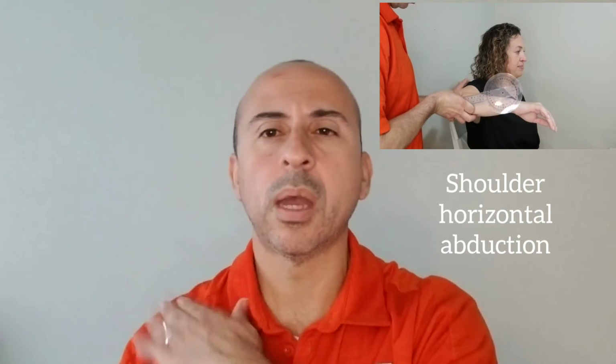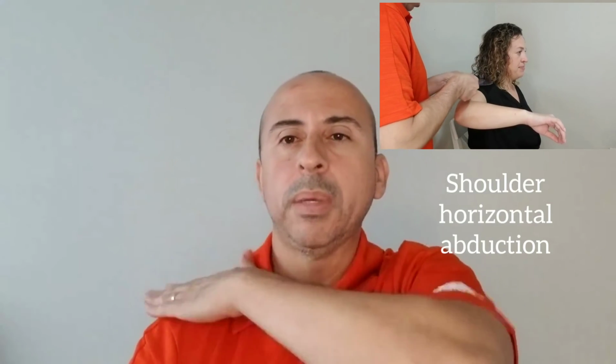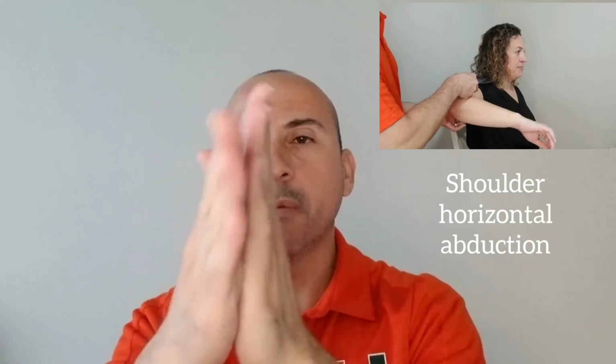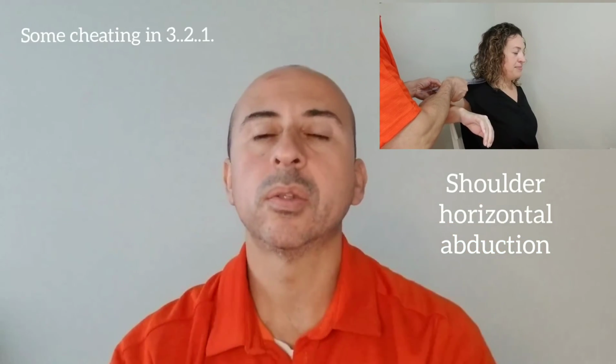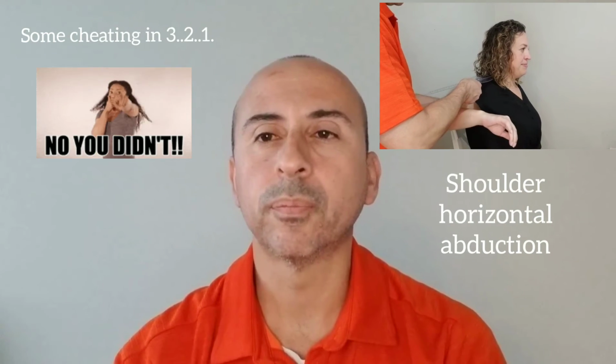they're just putting the goniometer in awkward positions. Like, for example, if you put the goniometer up here, okay, that's clashing with the movement. Remember, the goniometer is going to follow the movement regardless of what plane you're going in. So understanding that basic concept will help you with that.